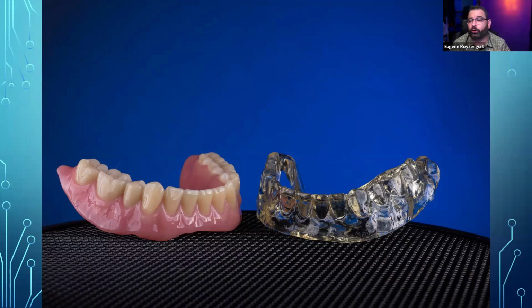As I mentioned before, I try to do a temporary denture, have the patient wear that for a while, and then use that to do my surgical guides to do the implant placement. And this is exactly what we did here. So we had a denture fabricated, patient wore that for a while, and then we made a surgical guide.